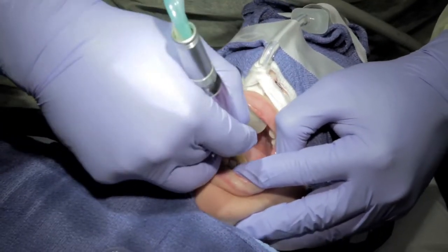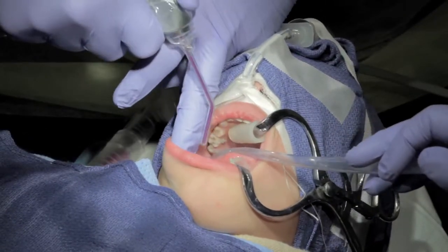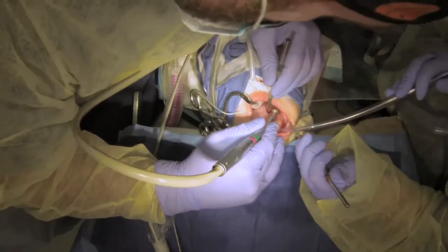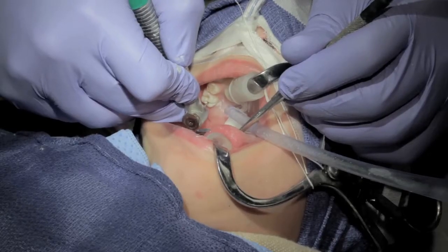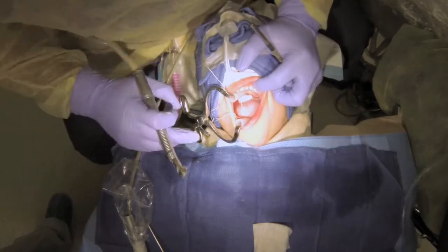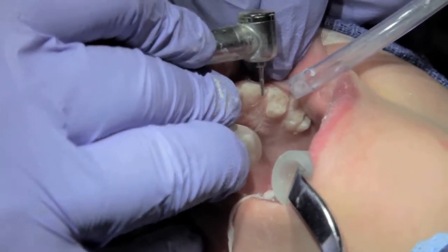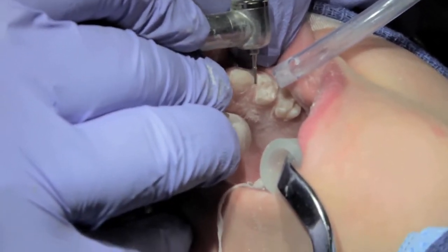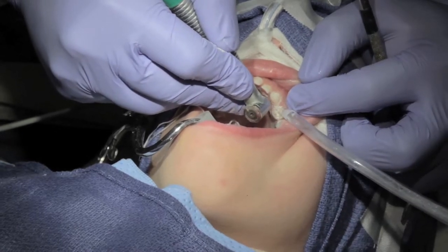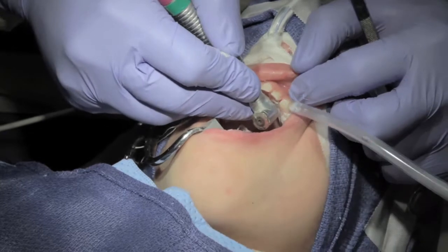That way you are treatment planning off of clean teeth, which makes it much easier to detect decay and not miss anything. We are going to prep a stainless steel crown on tooth number H. The first step is occlusal reduction, then I go in proximal. A good rule of thumb is to put the cutting edge of the bur at the reduced occlusal height table — that's how far I know to go subgingival.